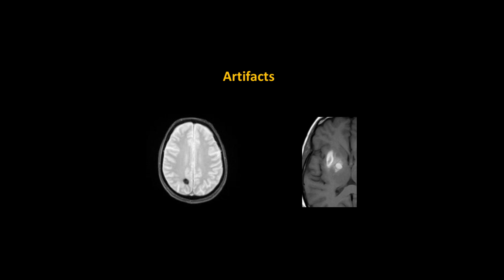The reason why I encourage everybody to check their data, besides the fact that we need to make sure that our data quality is good, is because you may come across something like this that did not get picked up by the scan technician. I have found 3 of these kind of artifacts in my entire career of doing fMRI analysis. So out of hundreds and hundreds of scans that I've run, I found 3, which is a fraction of a percent. But I found them.